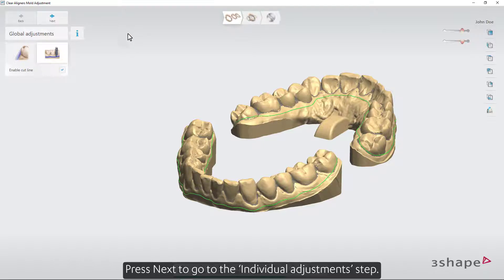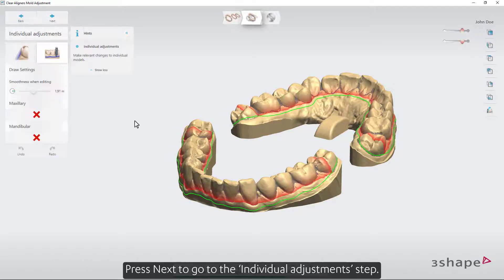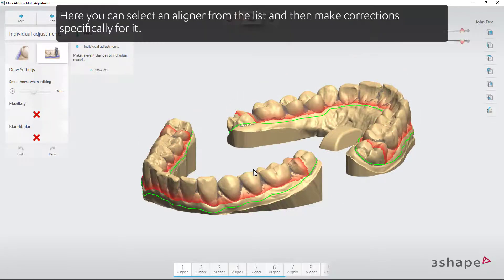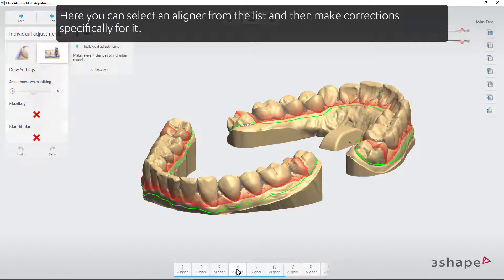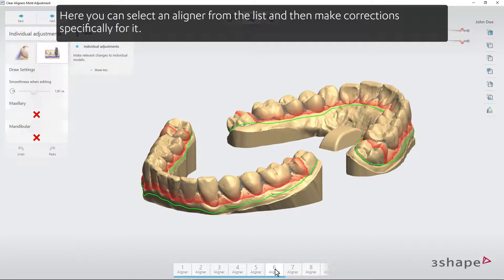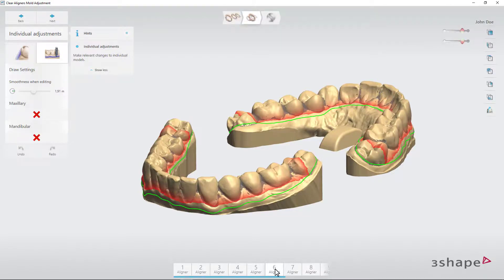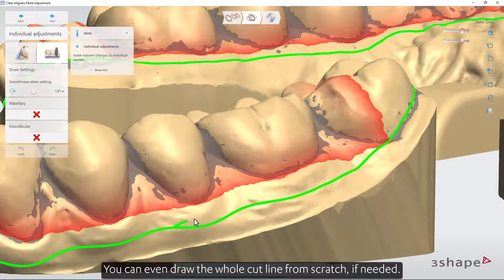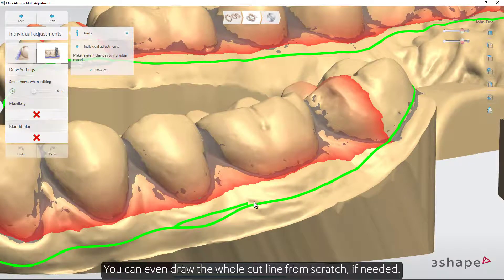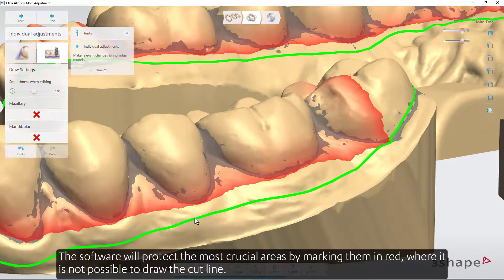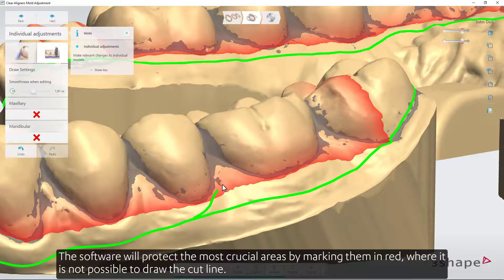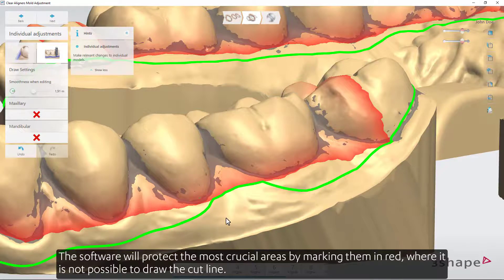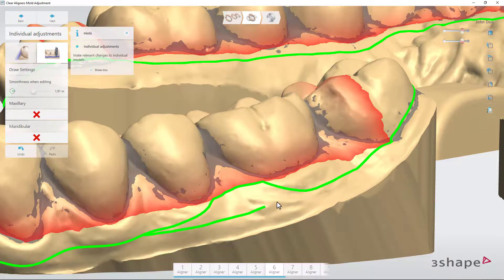Press Next to go to the Individual Adjustments step. Here you can select an aligner from the list and then make corrections specifically for it. You can even draw the whole cut line from scratch if needed. The software will protect the most crucial areas by marking them in red, where it is not possible to draw the cut line.